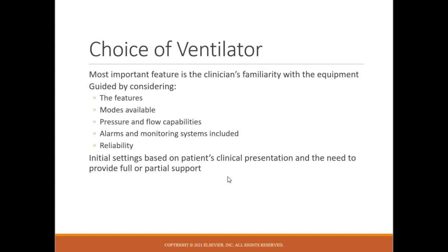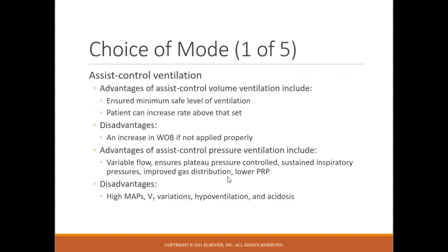There was once where we had an issue. One facility that I knew of had a really big issue with their ventilators failing. They bought all these new ventilators and their ventilators kept failing on them, and there wasn't tech support to come out and fix them. So they had all of these very, very expensive decorations in their storage room. So that would be another reason to choose a different ventilator. And again, we're focusing more so on just those initial settings being based on the patient's clinical presentation.